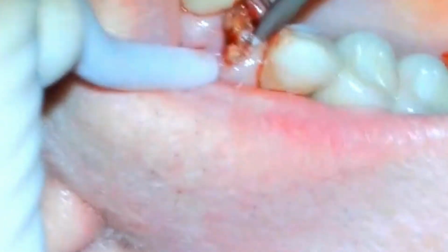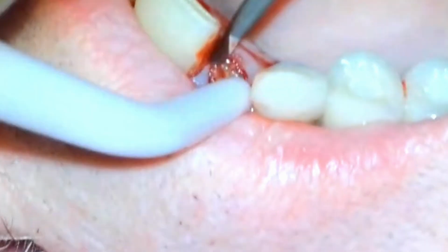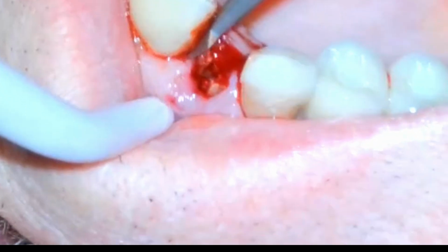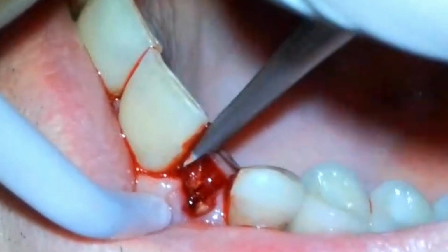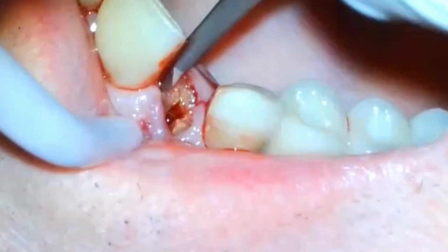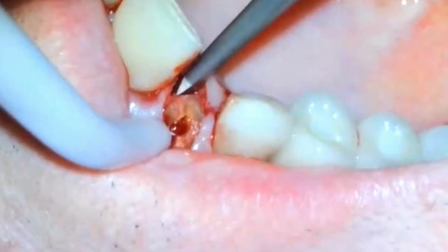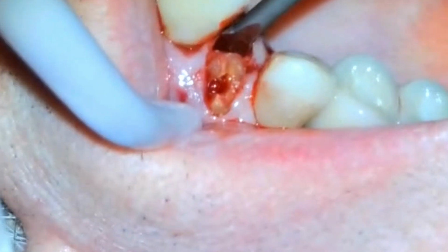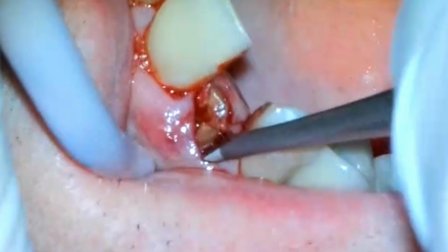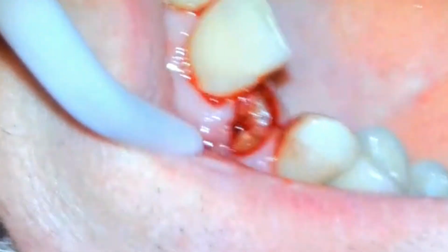Sometimes you can only get out what you can get out, and you've got to dig for it. But I always find with an area that's infected like this, it just makes it easier. The infection removed some of the bone, basically made the hole bigger, and now the tooth's going to want to move towards the lip to be removed. There you can see it coming, and it's pretty much out with the spade proximator. It's just attached by the gum on the lip side still. So I've got it out of the socket now, nice and loose.